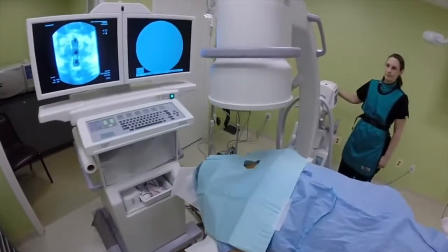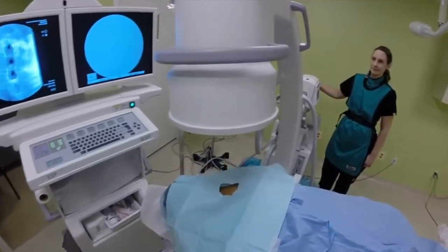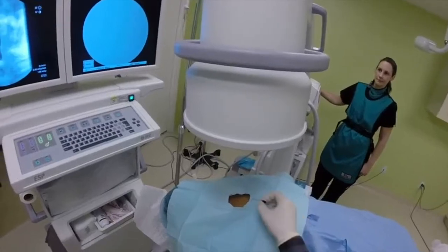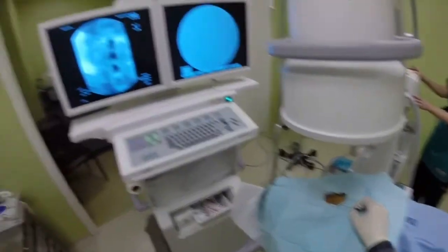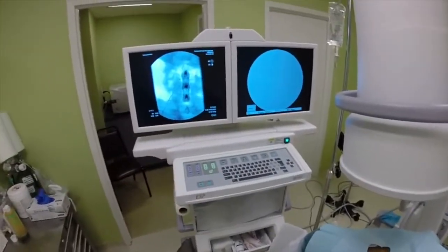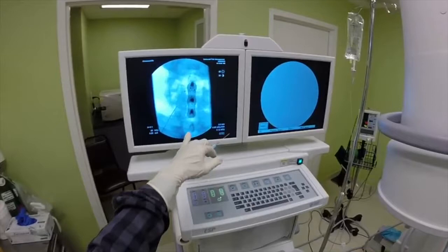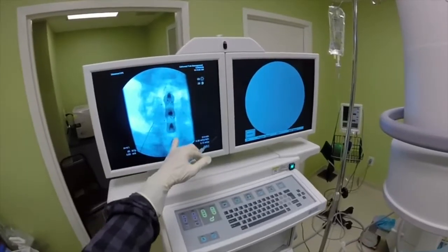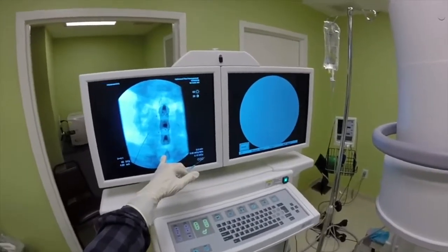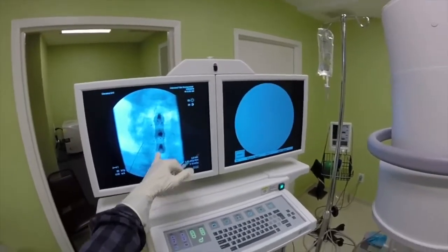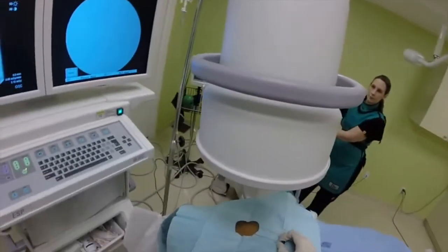We will start with the AP fluoroscopy. So this is the hardware and we are going to place the needle between T1 and C7.